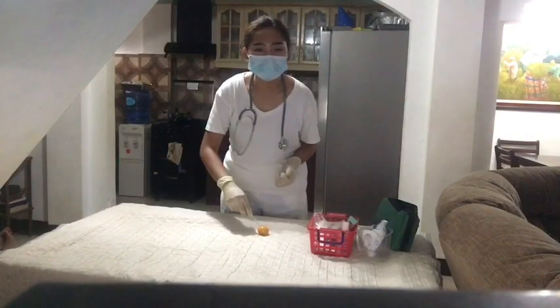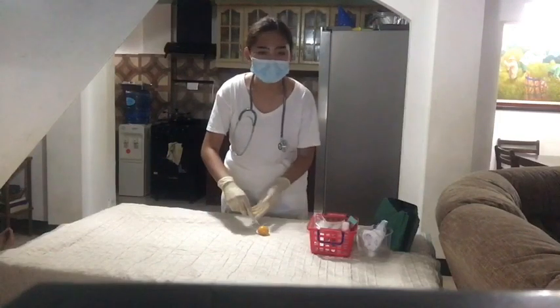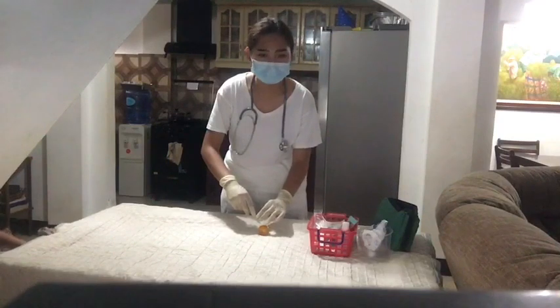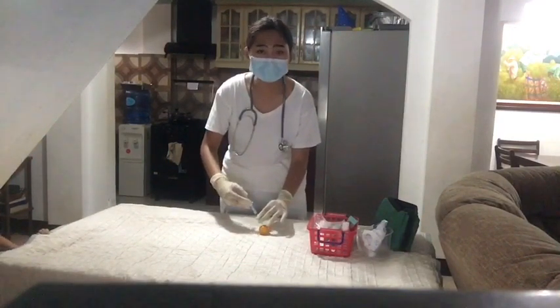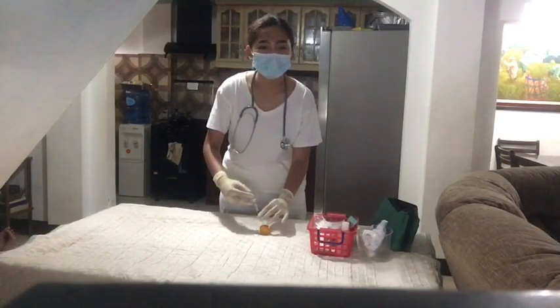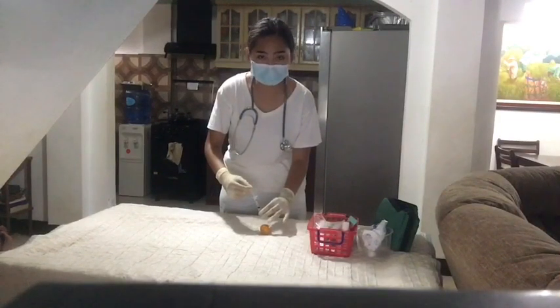We will now grasp the lower end of the syringe with the non-dominant hand and position the dominant hand to the end of the plunger and do not move the syringe. This is to prevent the movement of the syringe. Now pull back on the plunger to ascertain that the needle is not in a vein.